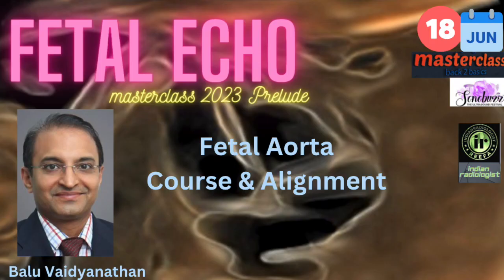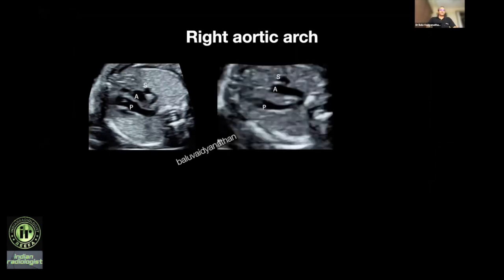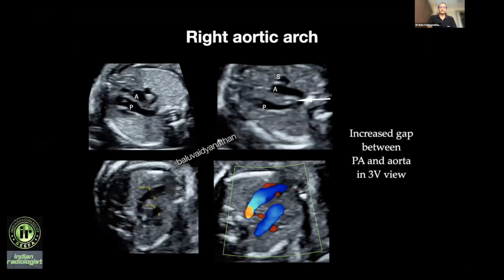Now we see right aortic arch. The first clue for right aortic arch comes from the three vessel view. A normal three vessel view shows three vessels stacked one upon the other, close to each other. Here you can see there is an increased gap between the aorta and the PA, and the trachea is actually seen already between the aorta and PA. In color also you can see this increased gap — that is the first clue for right aortic arch in the three vessel view.